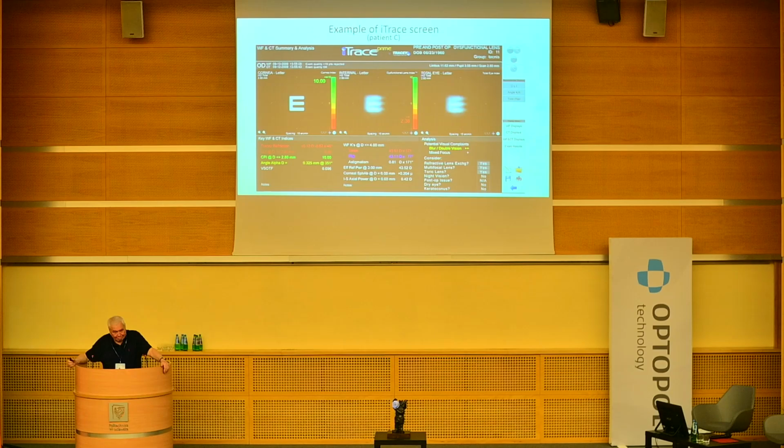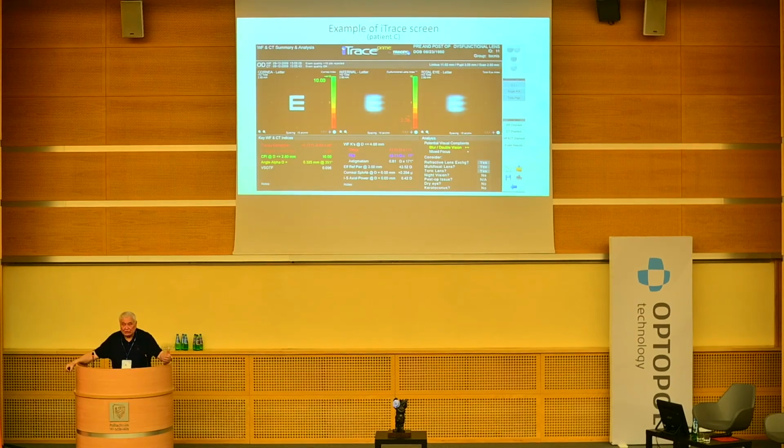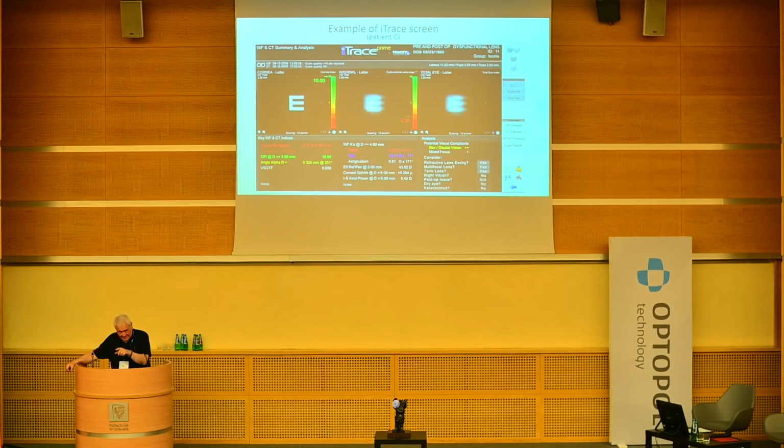But it is useful. So about 5 or 6 years ago, we met several people who work with Tracy, thinking about how to avoid this subtracting of two not very correlated things, because of different positions, different systems of coordinates. And an idea came to me to cross the cornea in the same point, and go in the lens two different traces, and then to compare these two different traces.